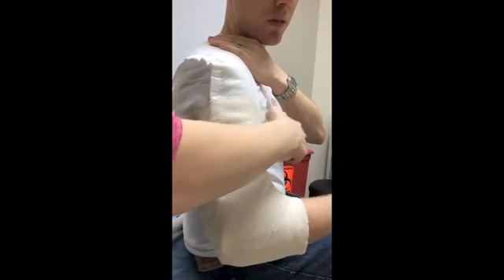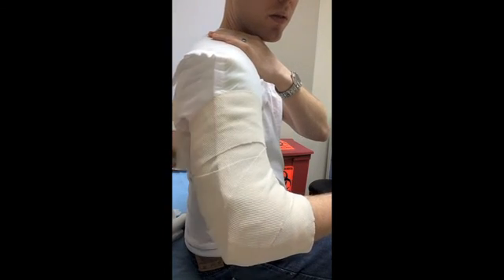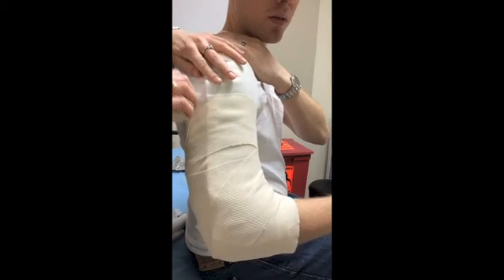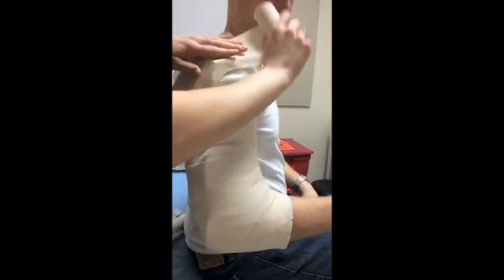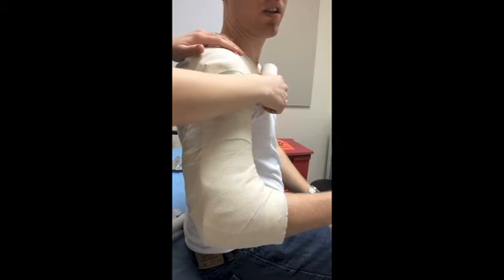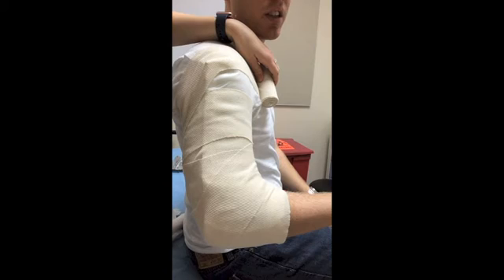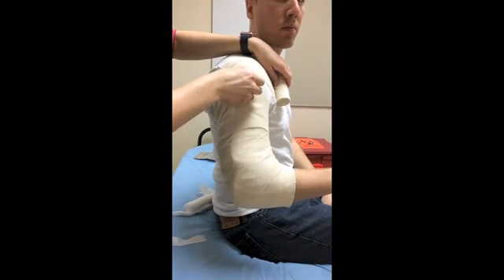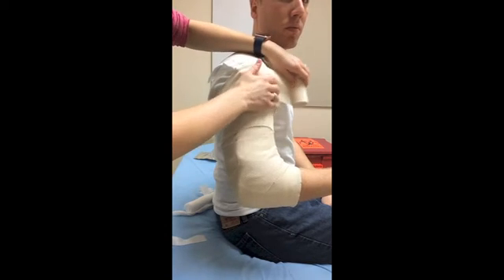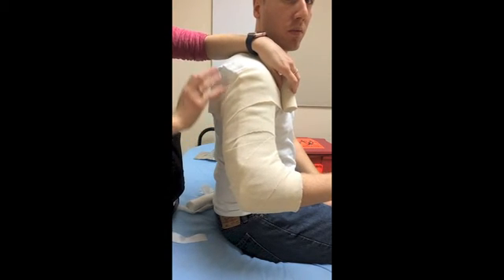But as we rise toward the top of the arm, it does get harder and harder to secure this back area. We'll do one more overlap here. So once we get toward the top of the arm, we want to get as much coverage as we can, but then this is about where we can end for a bias wrap.